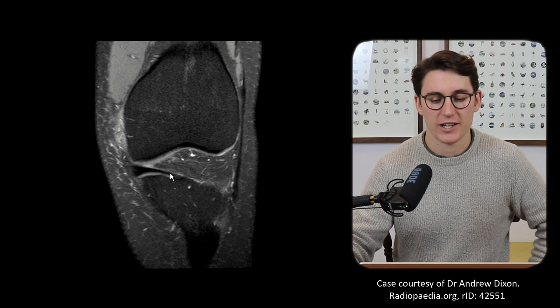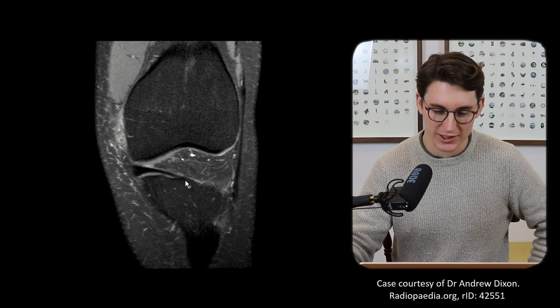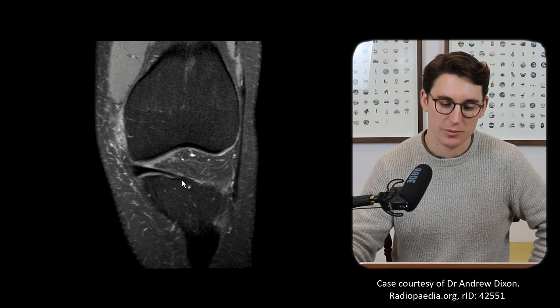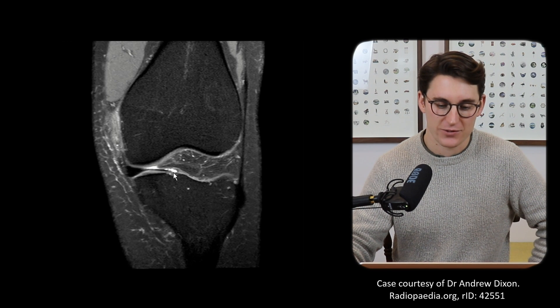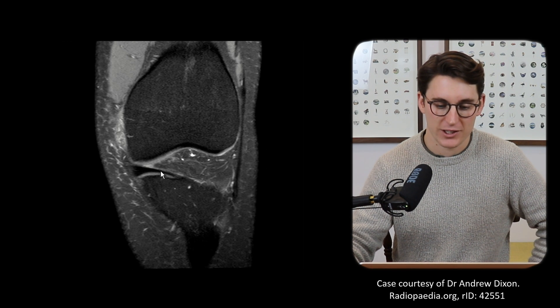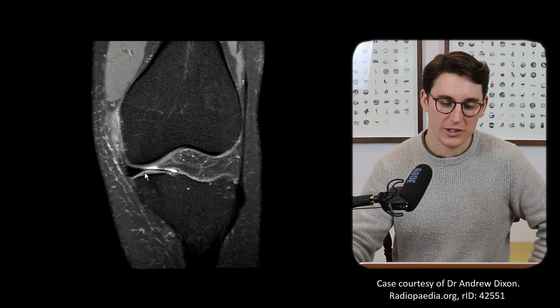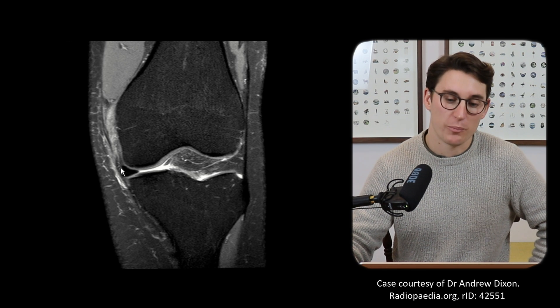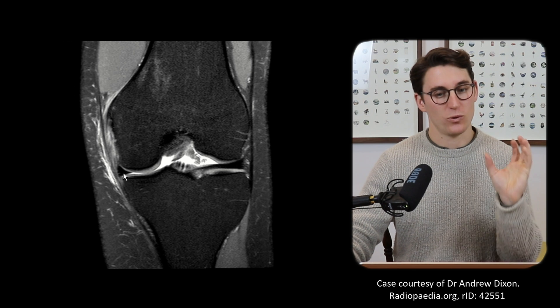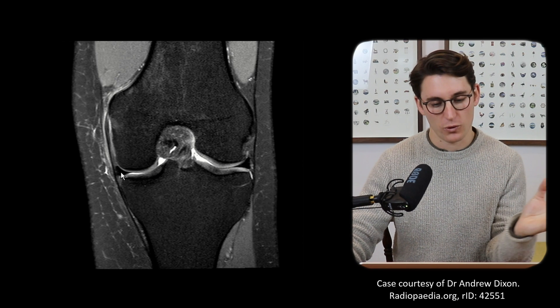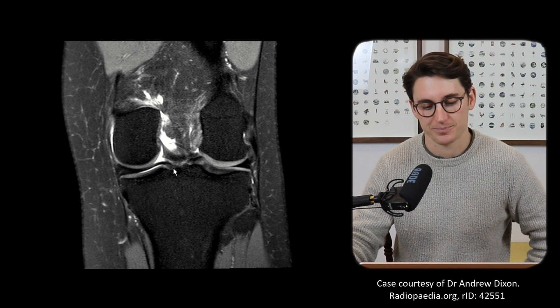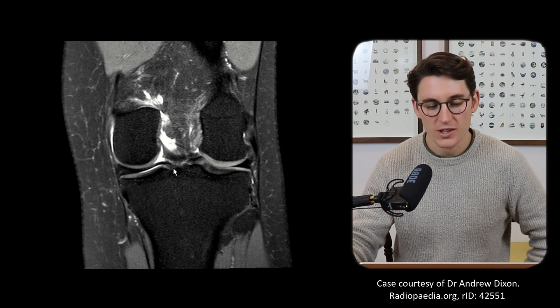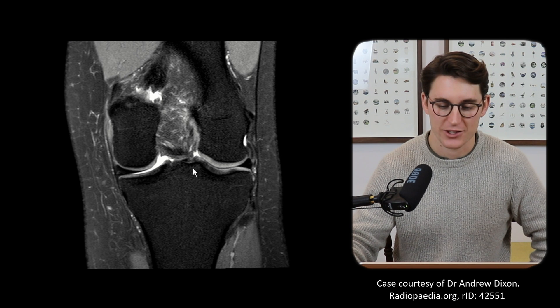Let's start anteriorly on the medial meniscus. We can see the attachment to the tibia — this is the anterior root of our medial meniscus. Following that around, this is our anterior horn of the medial meniscus coming into the body. The body heads all the way back before curving round into our posterior horn of the medial meniscus, and then attaching at the posterior root. We're going to look at these again in the sagittal plane.